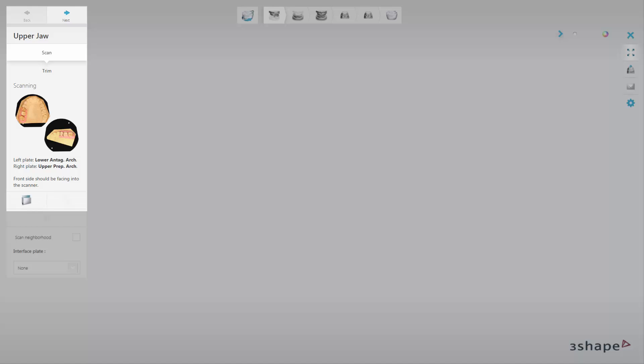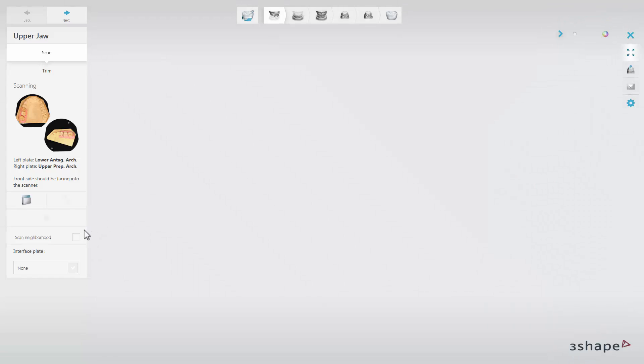In the left bottom part of the user interface window, each specific step has its set of tools. Here you have the possibility to add the Scan Neighborhood option to the scanning workflow. When you select that option, you are able to do an extra scan of the preparation arch without dies for better contact points.